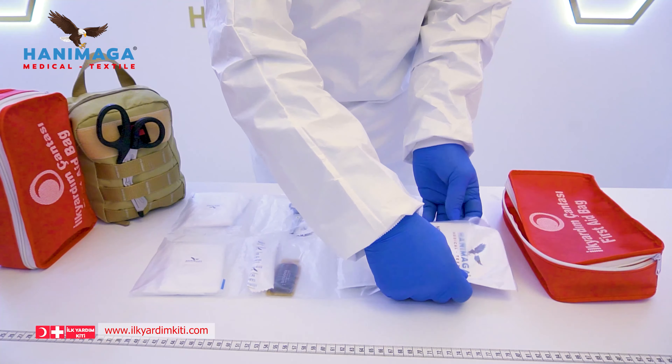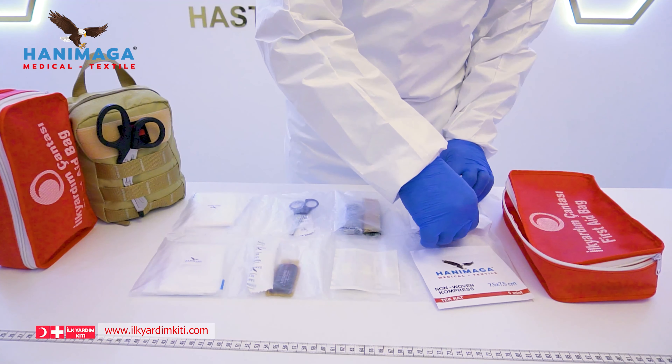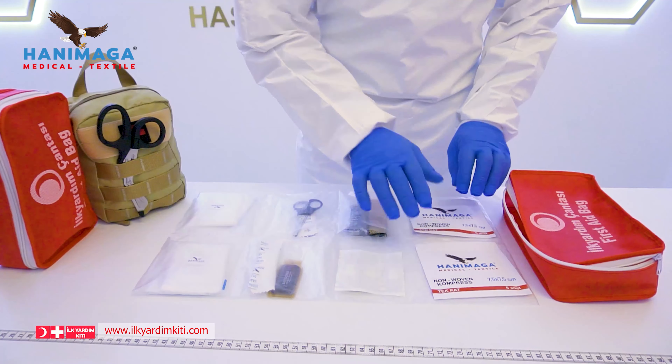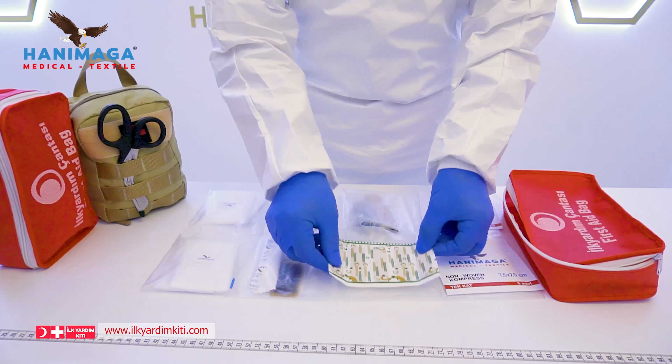Let's see the products in detail. We have two non-woven gauze compresses. Our standard packet also includes five band-aids.